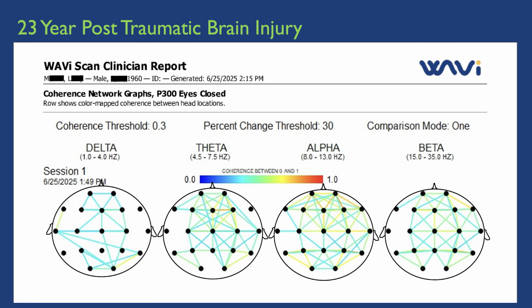And what the computer does, just thanks to Jaffe and Oakley, is it figures out which electrodes are synchronous, which pairs are most likely talking to each other. And I know that's real basic, and if Jaffe heard me say that, he would just castigate me. But that's really the bottom line: these electrodes have lines drawn between the different pairs in all the wavelengths. So the top of each graphic is the front of the brain, the bottom is the occipital, and the right is the right, left is the left.